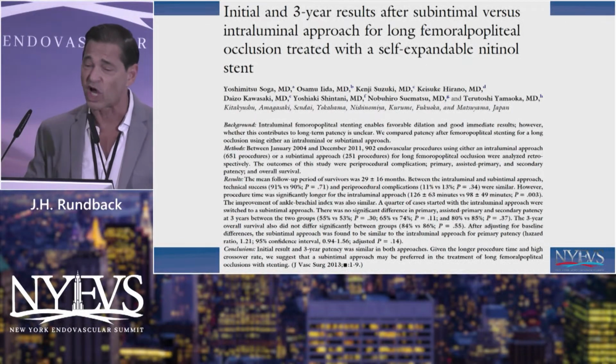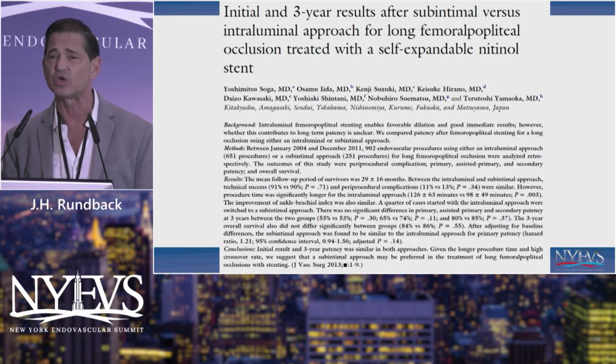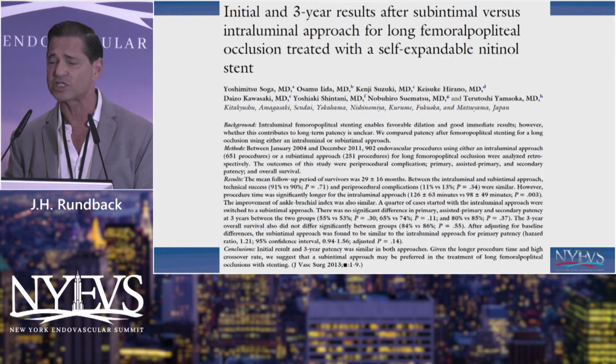So there is one sizable trial. This is actually not new anymore. This goes back to 2013, looking at subintimal versus intraluminal approach.